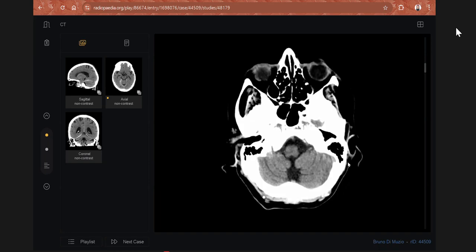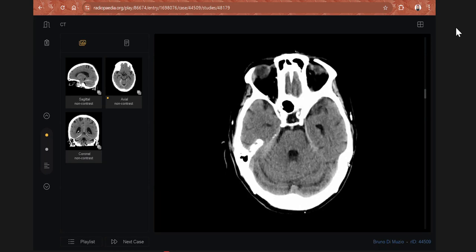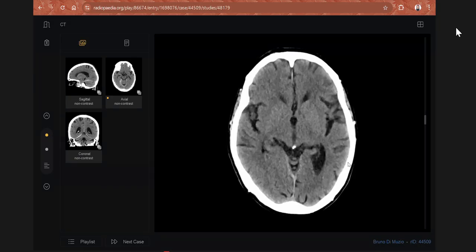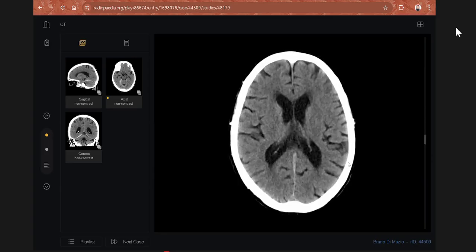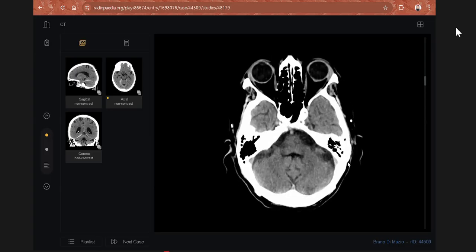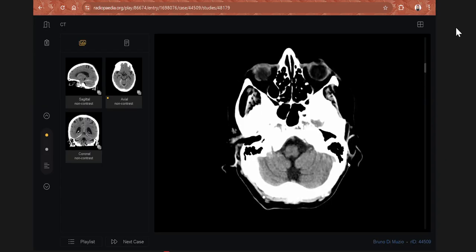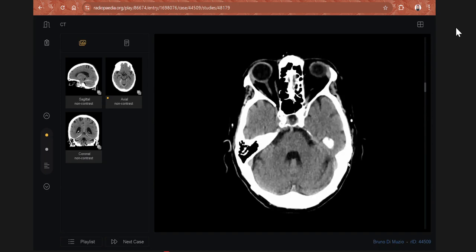MRI is very time consuming, and on CT the patient is in A&E. Sir, contrast enhanced studies will also delineate any subacute hematoma if it is there. And CT angiography could also be helpful if there is any evidence of rupture of any aneurysm that was present before. So you think maybe something in the tentorium? How do you confirm on the CT? Sir, if I can see the coronal images.